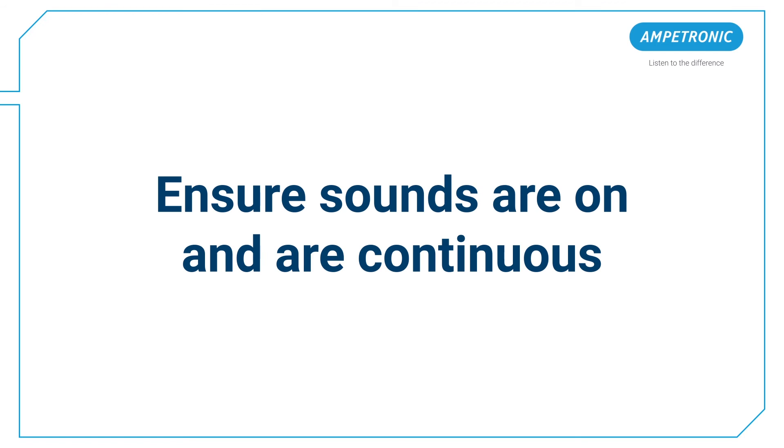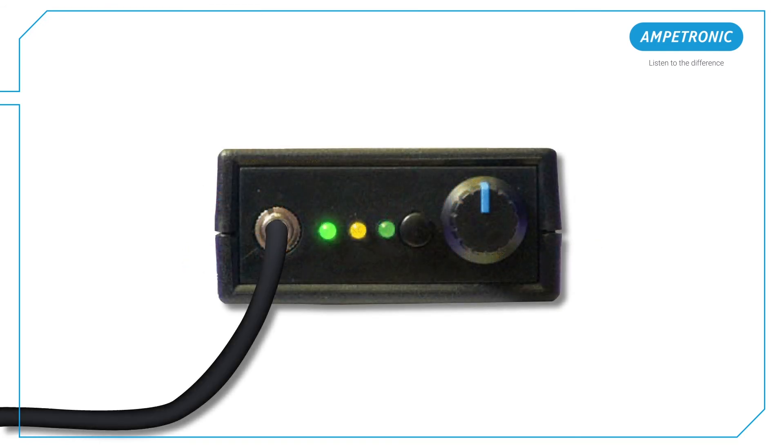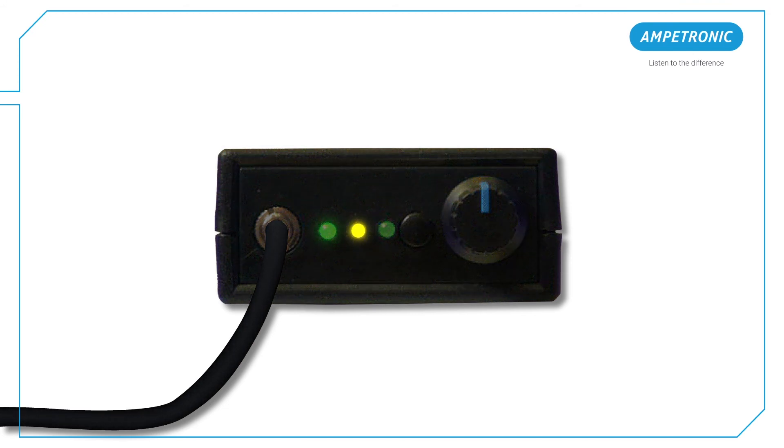Again, ensure sounds are on and are continuous. Whilst the sounds are active, watch the two indicators and compare them to the label on the back of the ILR3 Plus. If you see yellow on constantly, or yellow and green indicators both flickering, it's a pass. If green is on constantly, it's a fail — report the signal as too high. If the yellow indicator is only occasionally on, or both lights are off, it's a fail — report the signal as too low.